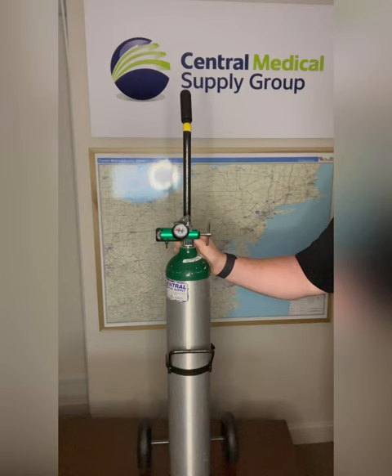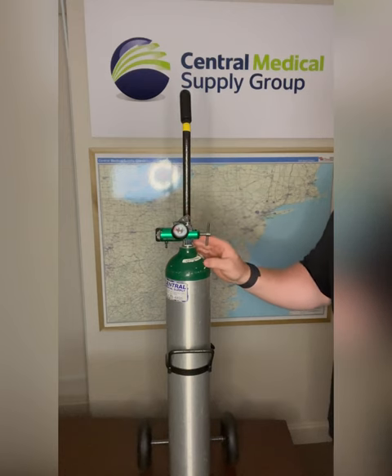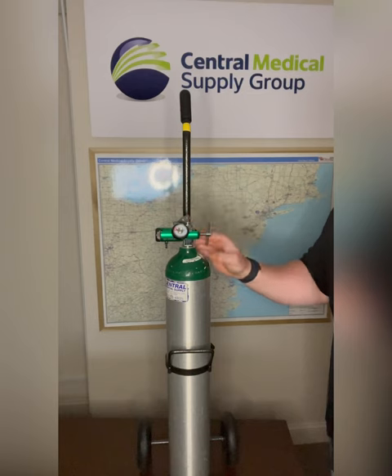Hey everyone, this is Brian from Central Medical Supply, and today we're going to go over the setup, use, and troubleshooting for a backup oxygen tank. In case of a concentrator malfunction or a loss of power in the home, we always provide a backup oxygen tank with all of our oxygen deliveries to ensure patient safety and comfort.